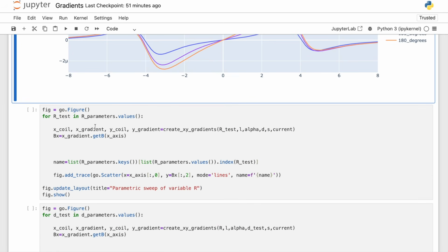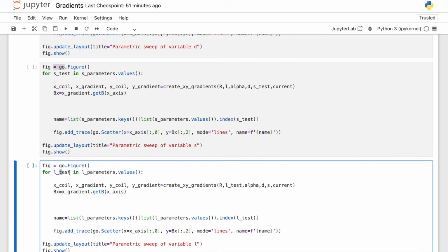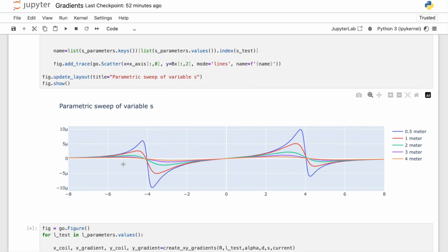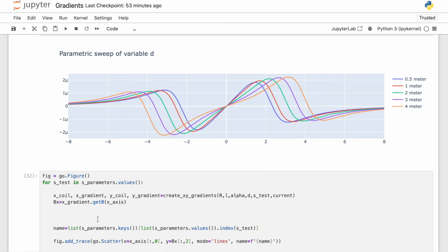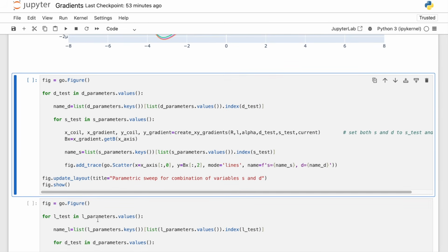Same way, we can run our parametric sweeps for R, and then we can do it for D, S, and L. So here are the results for D, here are the results for S, and finally here are the results for L. But so far we only did parametric sweeps for single variables, but as we discussed in the presentation, we can also do nested parametric sweeps.